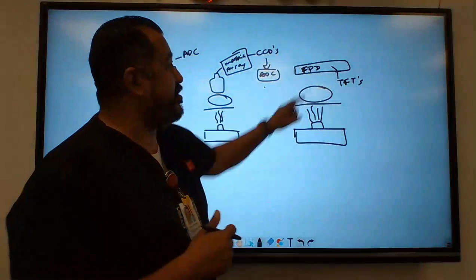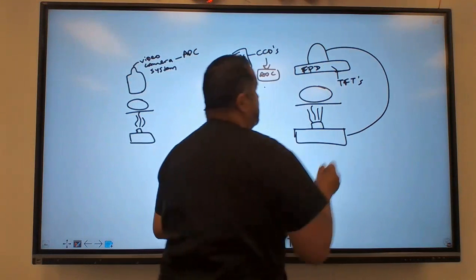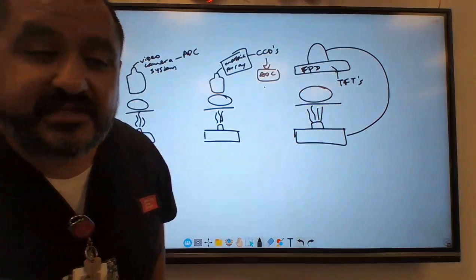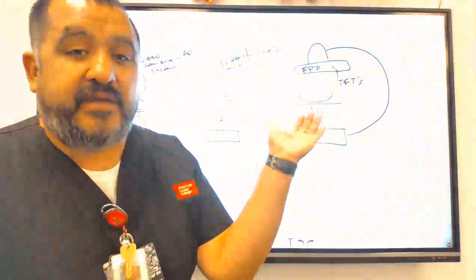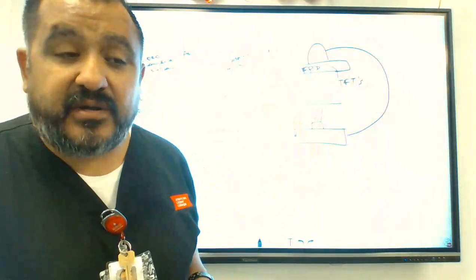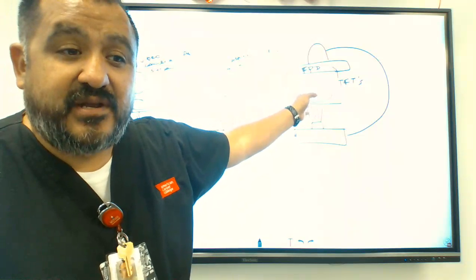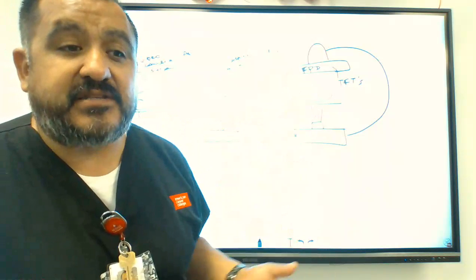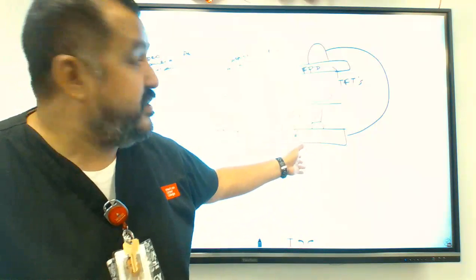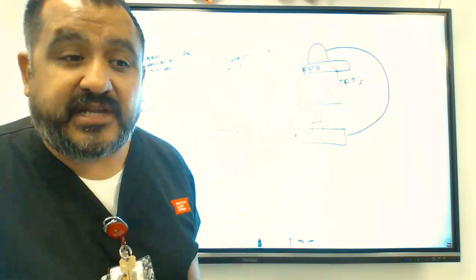So now there's a system called the flat panel detection system, and it looks like this. So it eliminates the intensifier tube. And when it eliminates the intensifier tube, you don't have that concave surface anymore. So you actually don't have vignetting at all. And because the detection system is very sensitive to X-ray radiation, right? You don't need to have that intensifier to amplify the light signal anymore. So it's actually more efficient. So all your brand new C-arm systems are called flat panel detector systems.